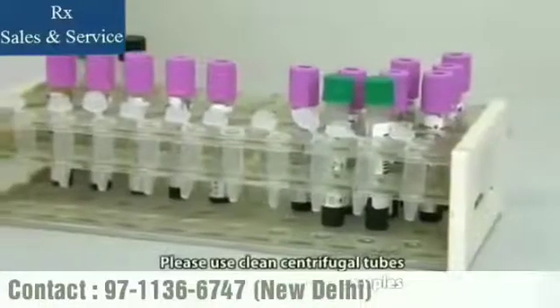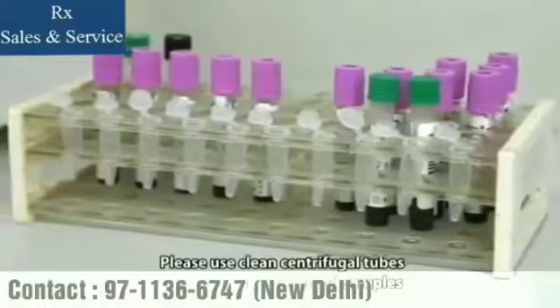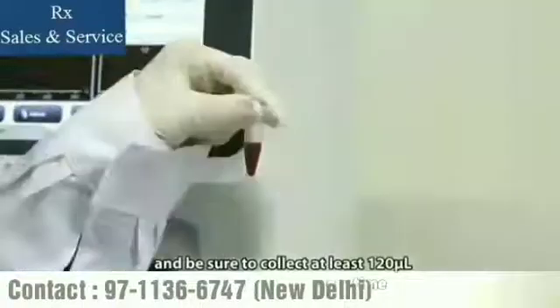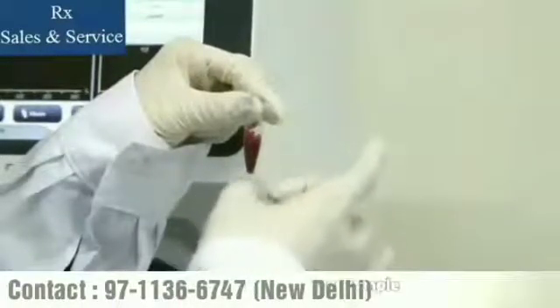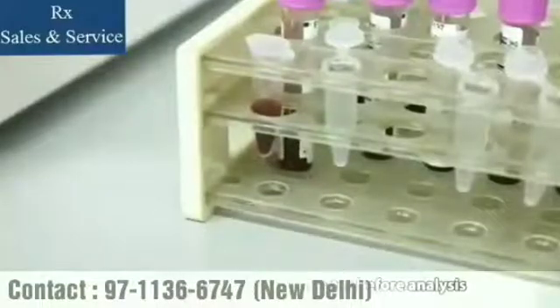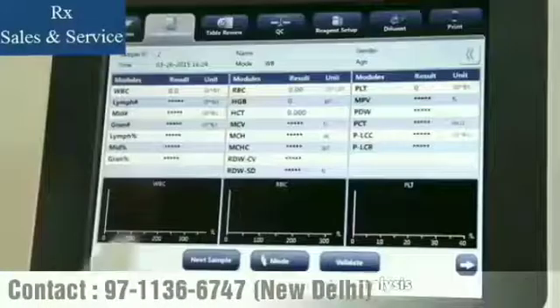Please use clean centrifugal tubes to collect capillary blood samples. Be sure to collect at least 120 microliters of capillary blood every time. After mixing the capillary sample, be sure to wait at least 5 minutes before analysis. You must complete the analysis within 2 hours after sample collection.